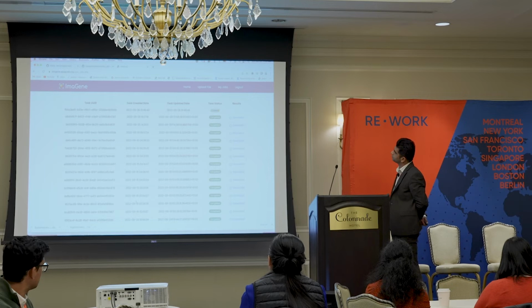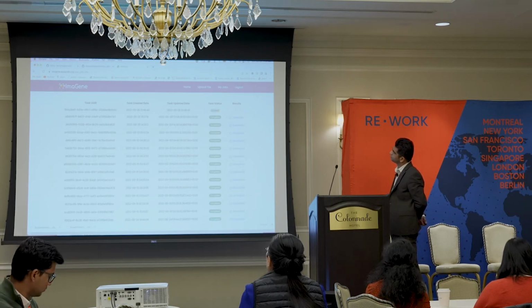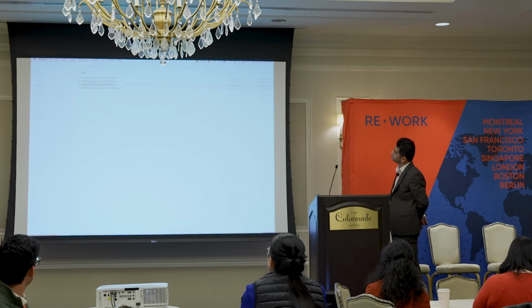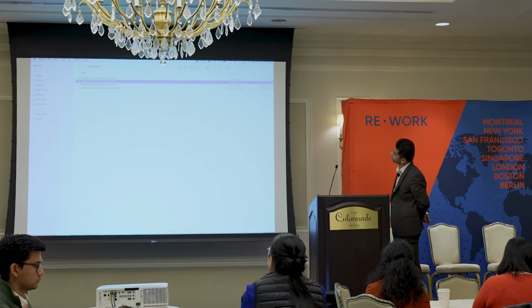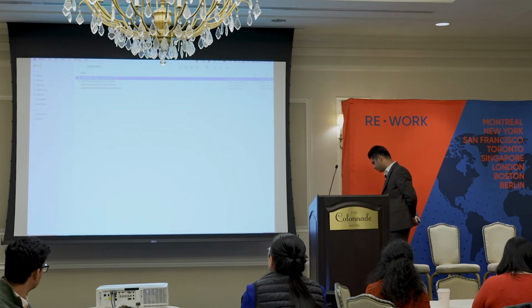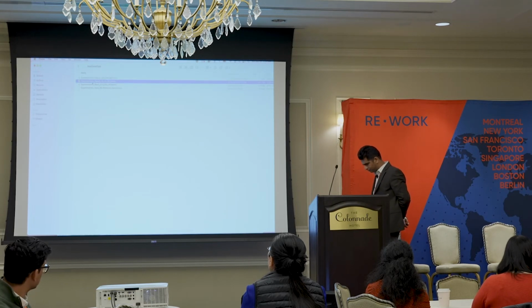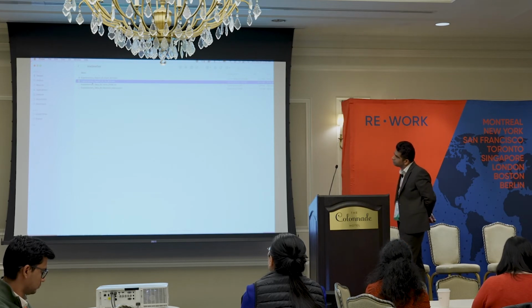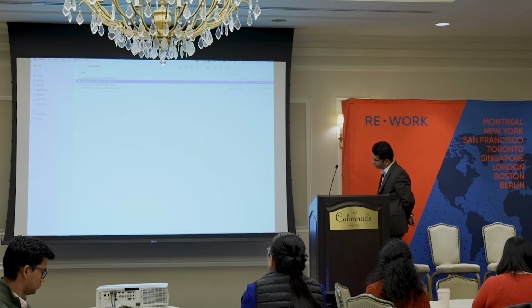For the sake of timeline here, I've already downloaded a report which was pre-cooked using the same approach. Here, you would see two reports coming out of ImaGene. One is with the correlation and the ML module. Another one is without the correlation module and the feature selection mode, which automatically runs through ImaGene. So you don't have to worry about setting the feature selection mode here.